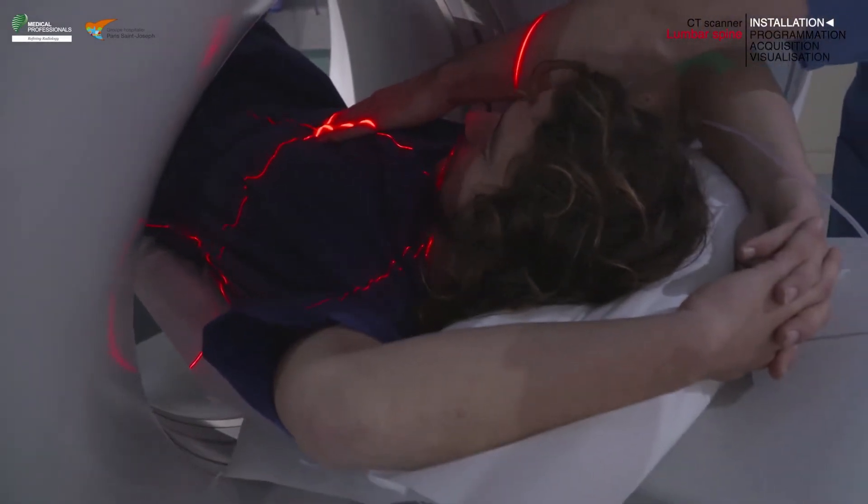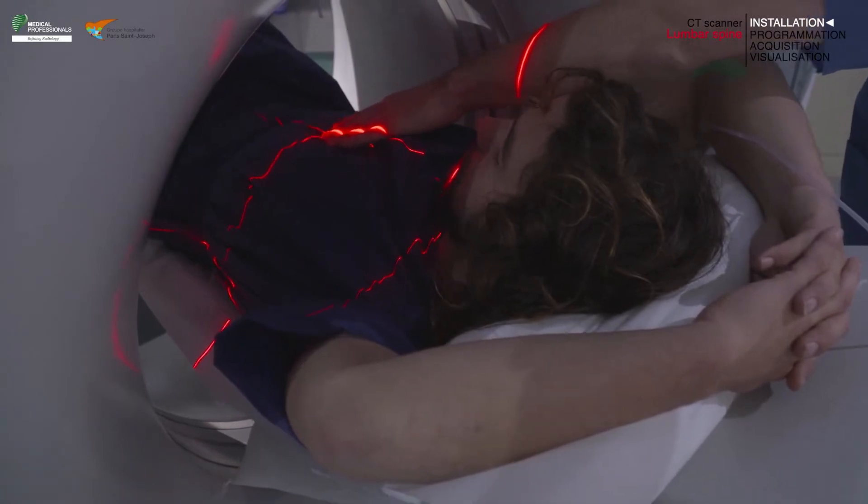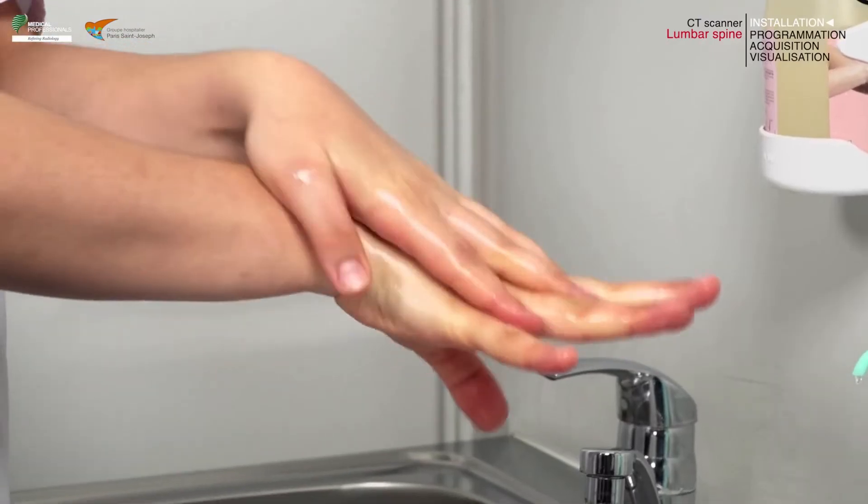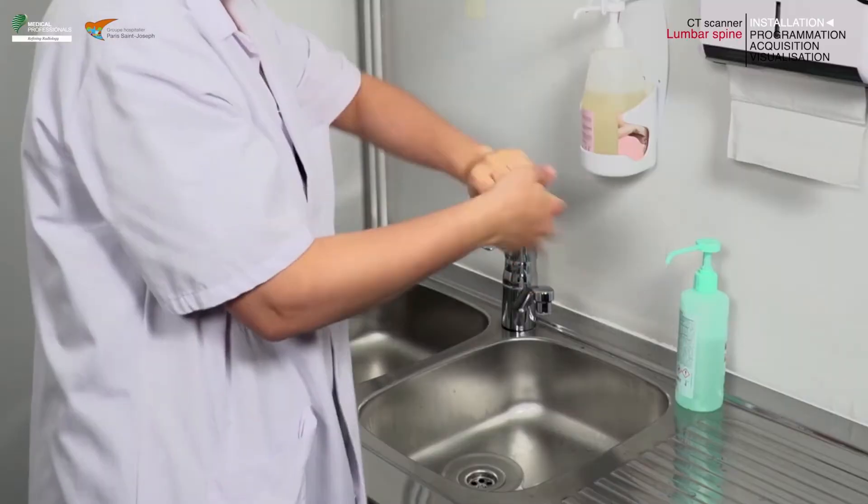Remember to close the doors of the examination room and perform proper hand hygiene, such as a rub with an alcohol-based hand sanitizer.